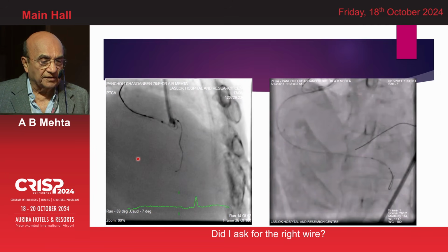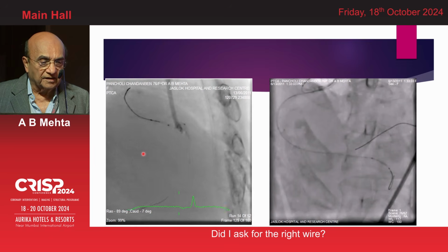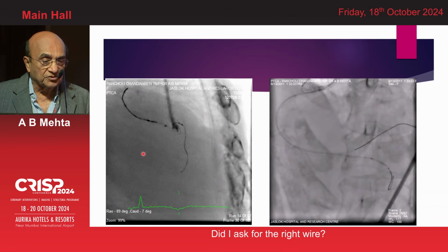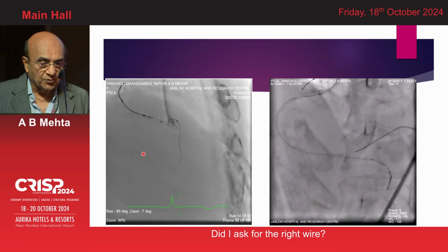Here is the anchoring balloon technique. Proximal wire, the branch has been anchored. While you are doing an anchoring balloon technique, make sure that the artery that you use should not produce ischemia, is comparatively small, comparatively less important.